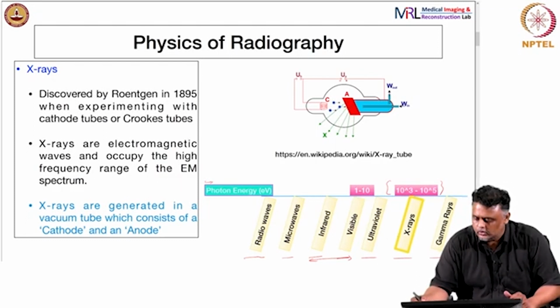This is one of the reasons why X-rays are also a safety issue, because they are slightly high energy and they can cause damage at the cellular level. So there are a lot of safety procedures built in place to avoid overexposure when examining a patient.